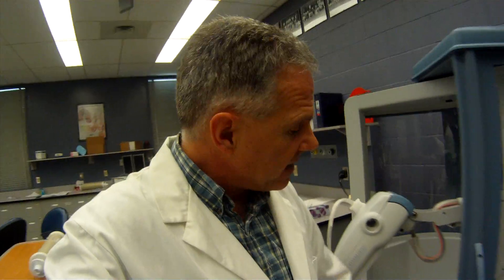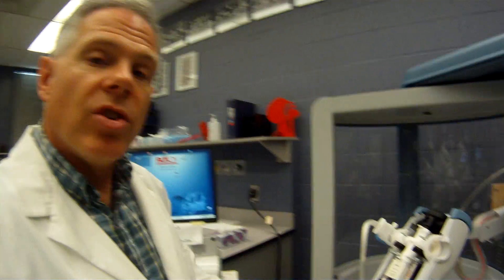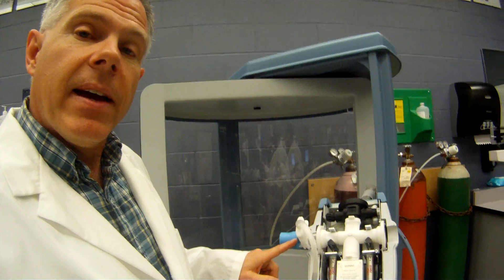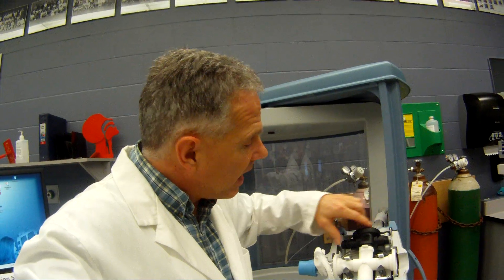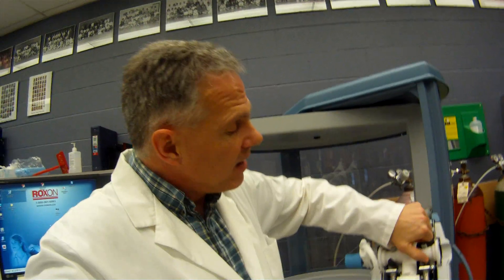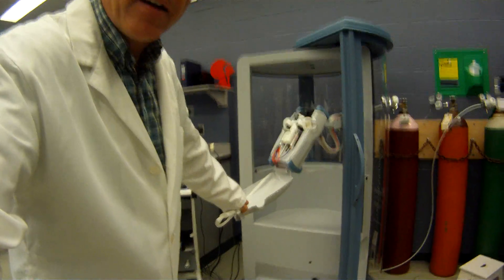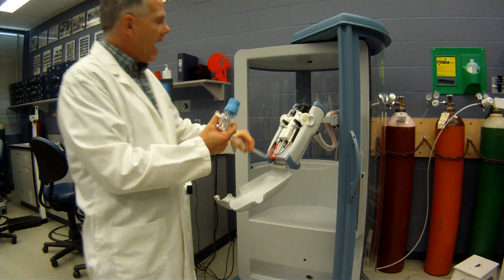The heart of the unit is the gas analyzer that we can't see — it's built right into the base there — but that's where all the gas analysis and all the pressure transducers are. What we can see in the functional unit for our patients is right here: this is the pneumotech, and this is the gas regulator. This is really the heart of the unit right here — our pneumotech.